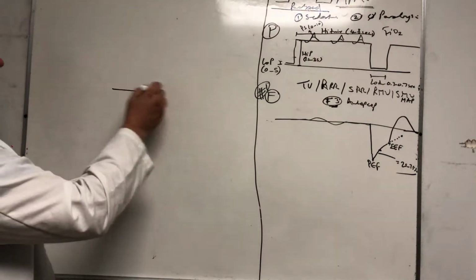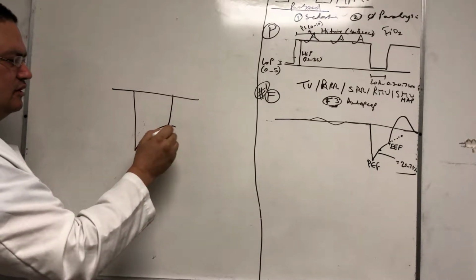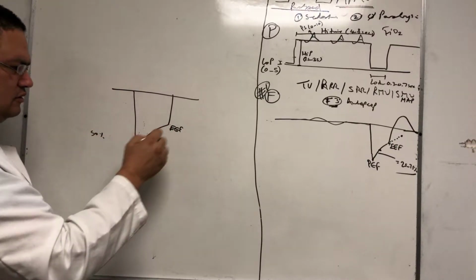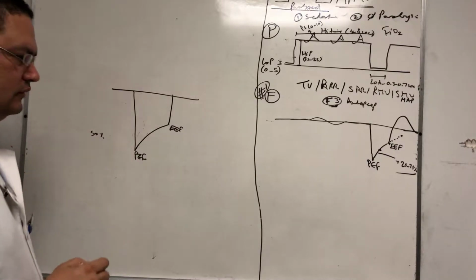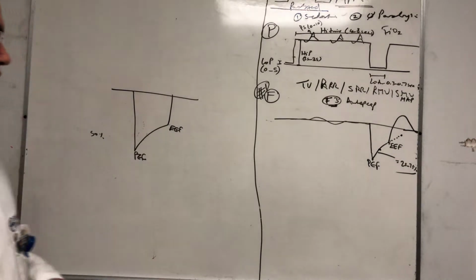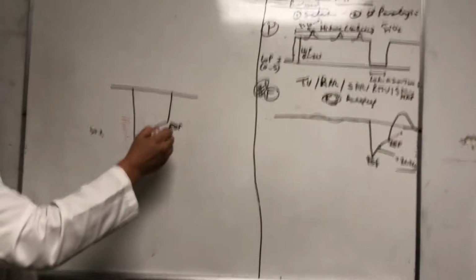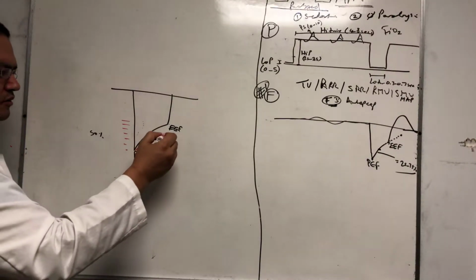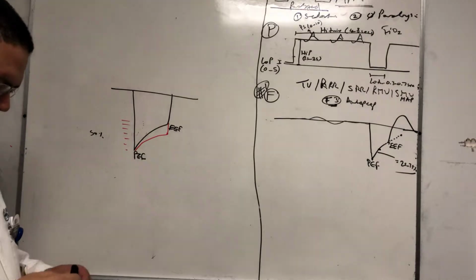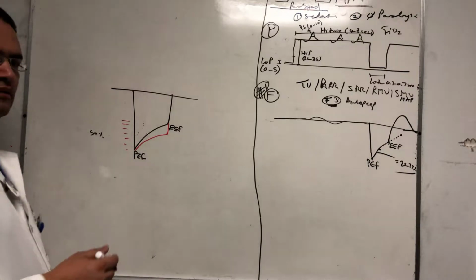So here, 50%. The end expiratory flow and the peak expiratory flow are 50% of each other. Now, for it to be higher than that, it is 60%. That means it went like this. This is 50%, right? This has to be 60% here, so the wave looked like this now. And if you think about it, the ARDS lung or the non-compliant lung, they switched again.